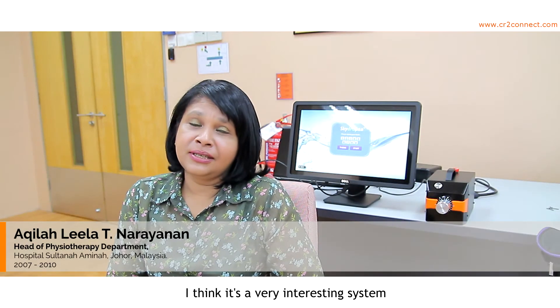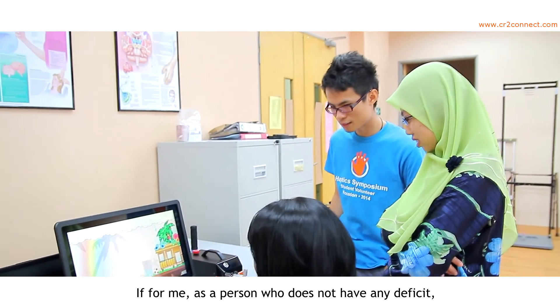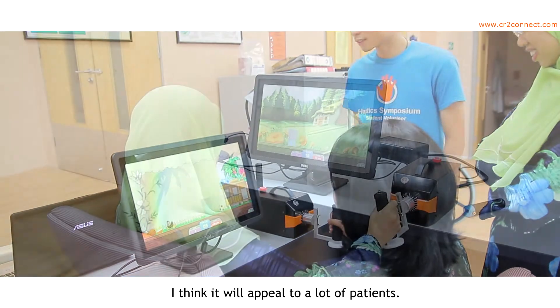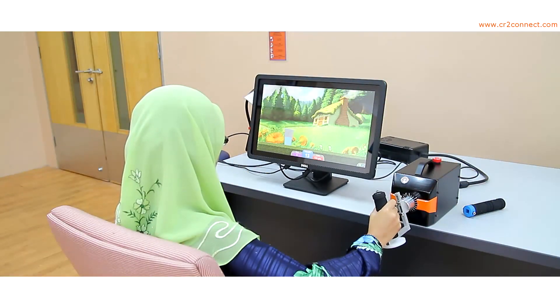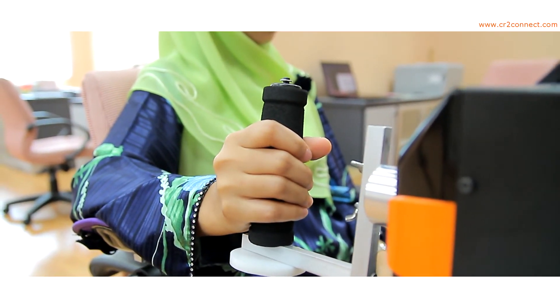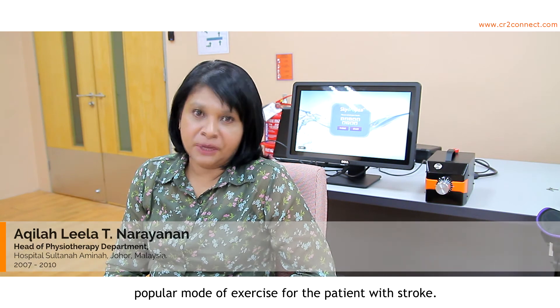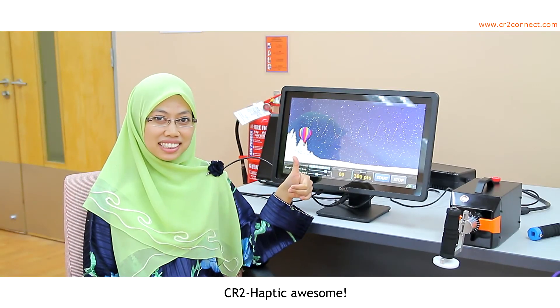I think it's a very, very interesting system and very attractive. For me, as a person who does not have any deficit, I find it very interesting also. It's very simple and I think it will appeal to a lot of patients. I'm very sure it will be a popular mode of exercise for patients with stroke. It's very useful for stroke patients. Well done. CR2 Haptic — awesome.